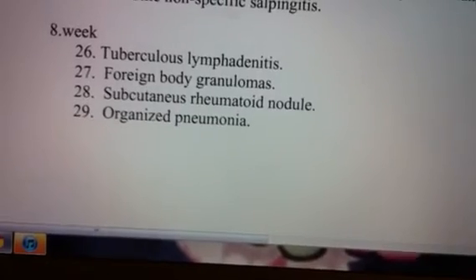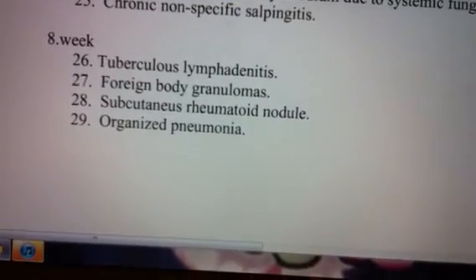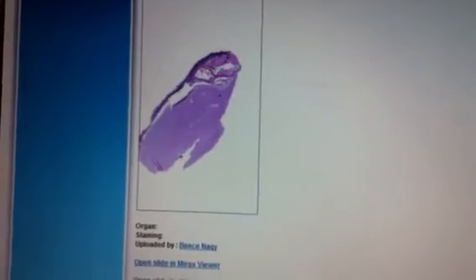Purulent meningitis. This is the one. Doesn't follow the order of the book, so I'm kind of unprepared. Difference between meningitis and encephalitis is what? Meningitis affects the meninges, of course. This is the way the slide looks. I'm sorry I didn't prepare that. Okay.